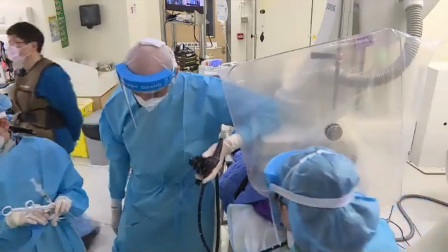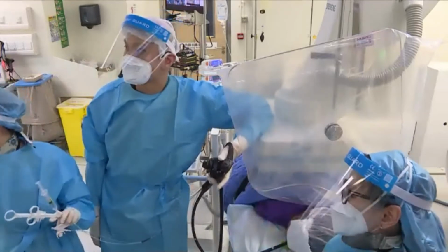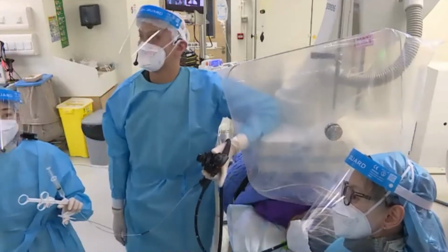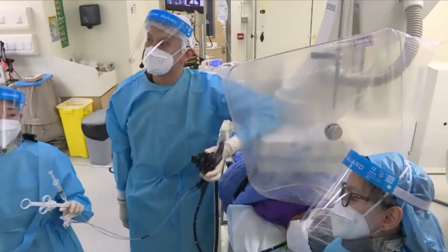Yeah. So one of the questions: whether the coming disposable endoscopes, do you think it's cost effective and the quality will be the same as the current scopes? No, I think the quality is not bad actually. Quality is probably 80% of the current scopes that we have. There's certain limitations, but I think the major problem is the cost.